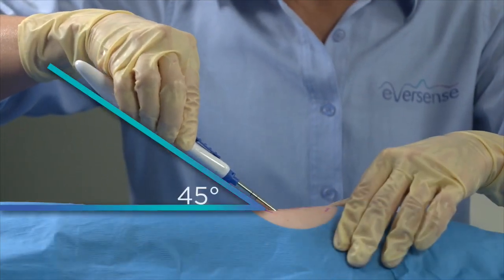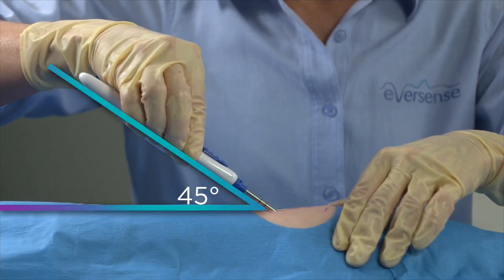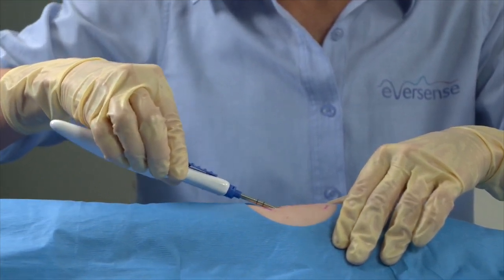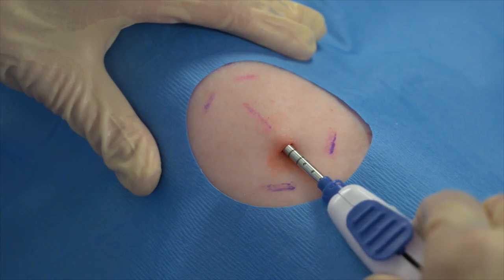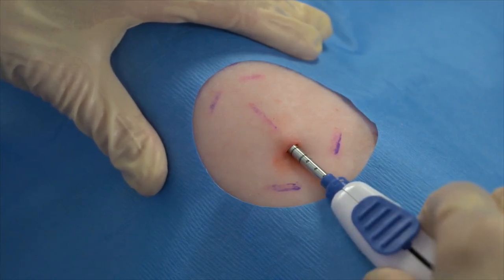Using the same 45-degree entry angle used with the blunt dissector, place the tip of the insertion tool into the incision opening so that the tip of the cannula enters the incision. Drop the angle of the insertion tool flat to the skin and advance it into the pocket that was created by the custom blunt dissector. Do not use excessive force to advance the insertion tool into the pocket.